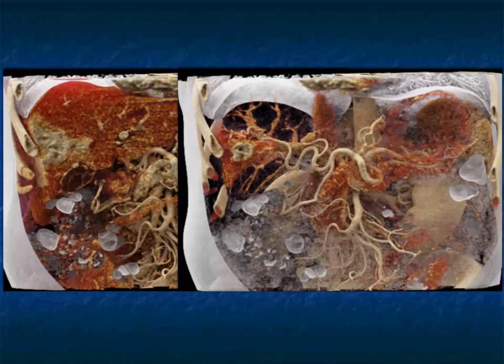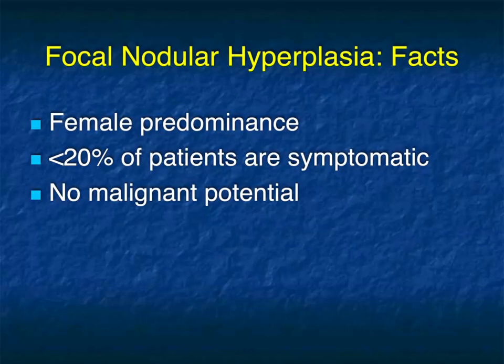Here's the same patient on MIP imaging showing the enhancement and perfusion changes, and also on cinematic rendering. The majority of hemangiomas are classic and we can make the diagnosis in 90% of cases or more, but sometimes it can be a bit of a challenge. Now, another lesion that I really like is focal nodular hyperplasia. FNH is important because it was the first paper I ever wrote, but also because FNH can simulate malignancy if you don't think about it.